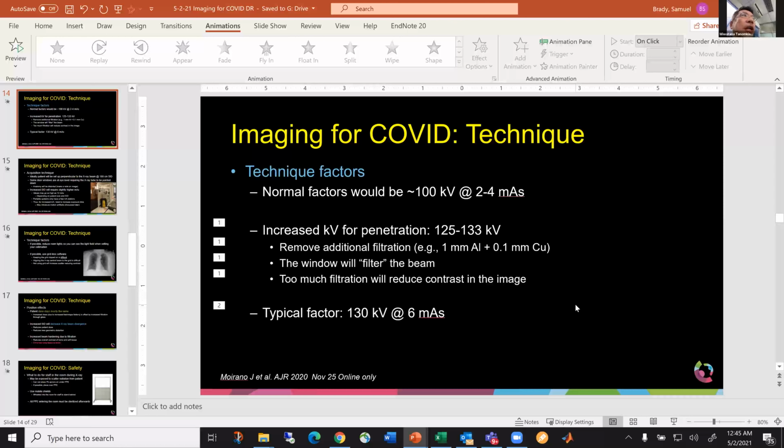And chest X-ray, chest radiographs are done not every day, but very often for the mild patients to make sure that there is no lung involvement. For COVID-19, the early lung involvement, the radiologists need to observe the lung markings, the lung vessels very carefully because early infiltration will make those lung markings blur.